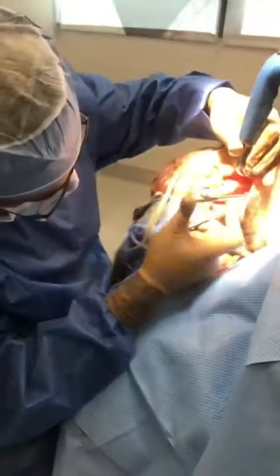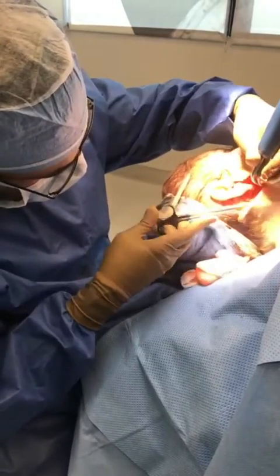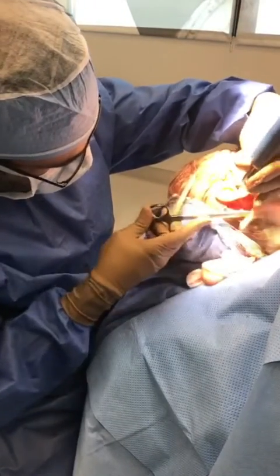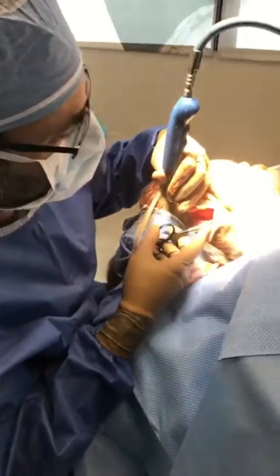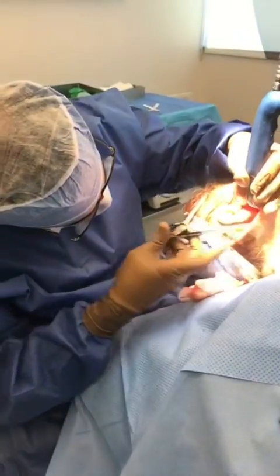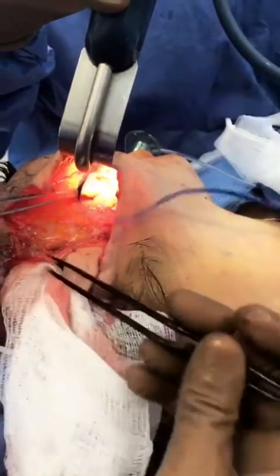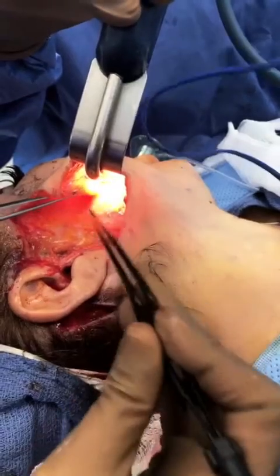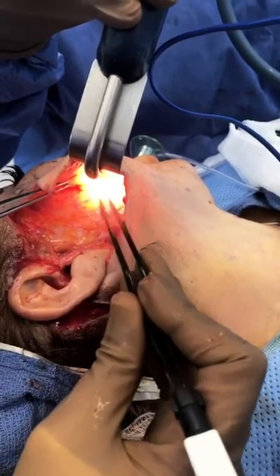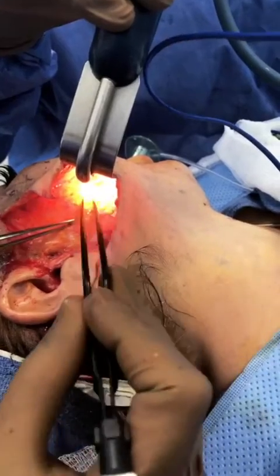So we've done the lip lift, the upper eyelids, the brow lift, we've done the neck lipo, we've done the neck lift, and now I'm doing the vertical portion of the neck lift over here, and then we're going to move on to the face. So right now we're doing the buccal fat release. Since we're in a deep plane, we can actually get the buccal fat out just like that by teasing it out nice and easily. Here it comes.